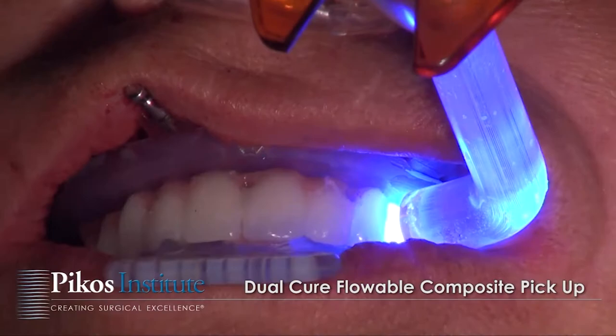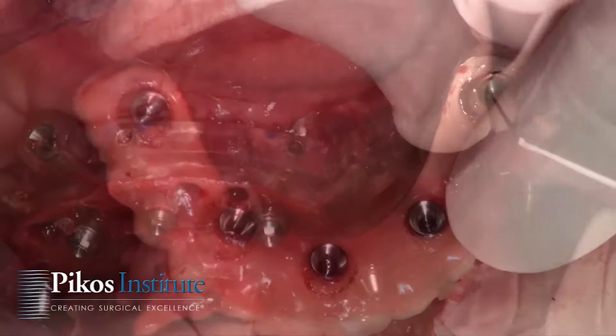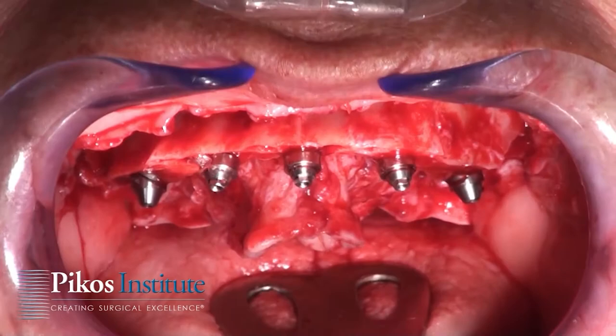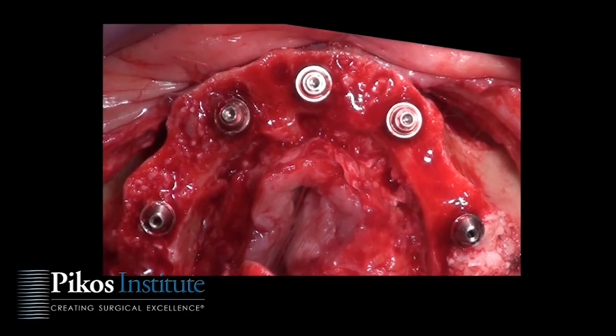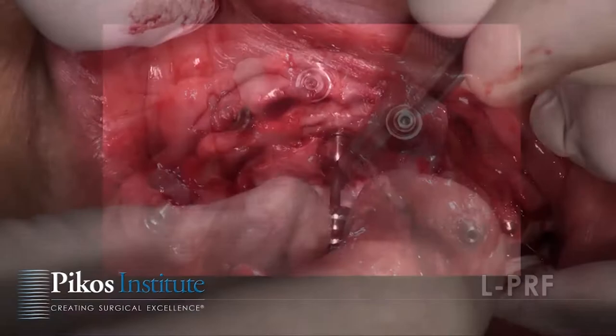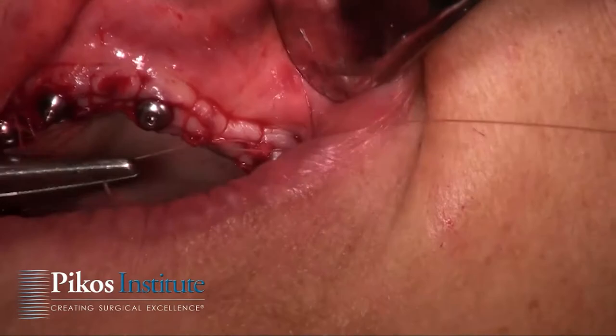This is a refinement of the prosthesis that will be done once it's removed from the arch. While my restorative colleague handles that, I will surgically graft any residual defects and achieve primary closure. We have a good bird's-eye view of the implants in place with multi-abutments. We're grafting around and into the defects using particulate autogenous bone, fine mineralized allograft as needed, and PRF fragments and PRF membranes. There's our primary closure.